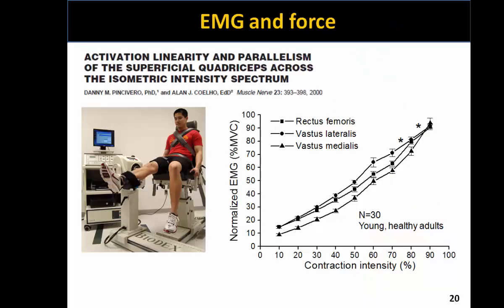And so this particular study sought to examine the pattern of muscle activation as a function of force level. Participants in this study, as you can see in this sample photo from the internet, used a device to sample isometric knee extensor force production during 3 maximal voluntary contractions.